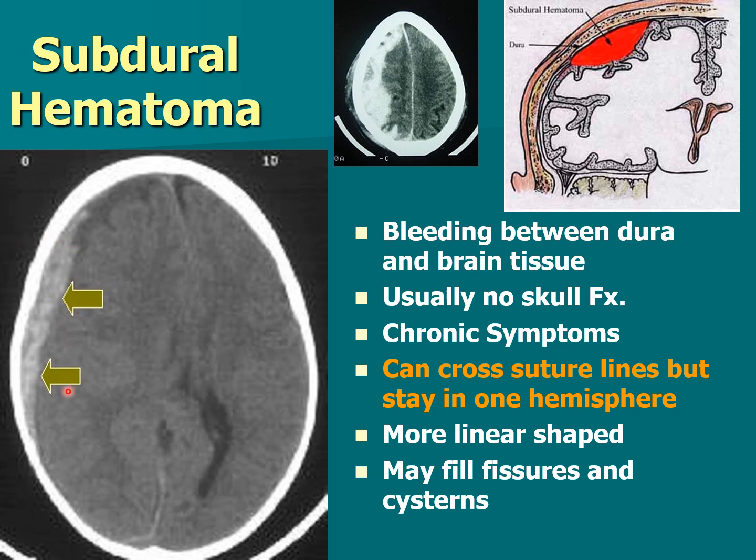It's more linear shaped, as you can see, and it may fill these little fissures of the brain here because it's going here. So it may have more of a ragged appearance because it's going into those little indentations in the brain.